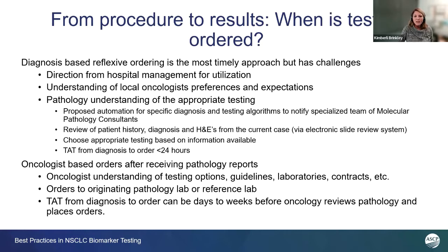So we're hoping that we can improve on pathology services and automate that a little bit more in the future. It's really been a long-standing process where there are very different ways for pathologists to result different information in their particular sign out. And so we're trying to fine tune that and make that a little bit more automated. So how they result, which different diagnosis they actually present for the patients would then trigger some automation where we could then reflexively add these tests on.